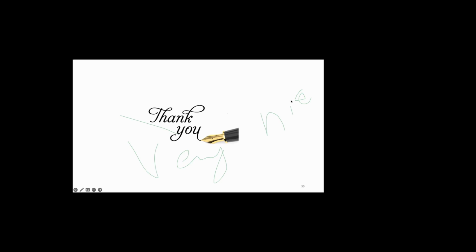But if we are not able to find a gland, this may not actually help us to identify it. But radio guided can help us. So if we have done sestamibi in the morning, if there is a little bit of sestamibi retained within the parathyroid gland, doing a gamma probe identification can help.